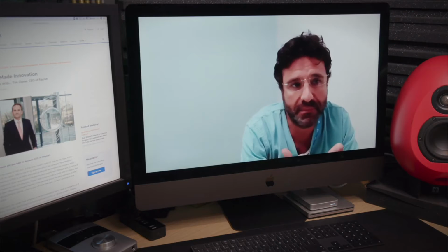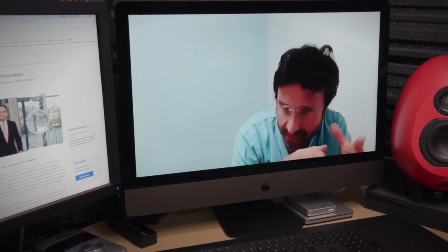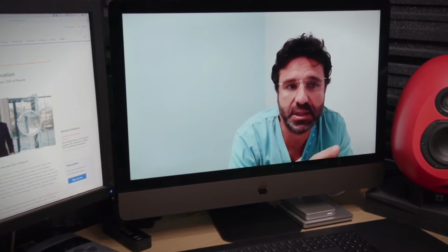And could you share what monovision offset you have been using with this lens? I've been targeting -1 to -1.25 in the non-dominant eye, and plano to -0.5 diopters in the dominant eye. The patients start targeted with -0.5 diopters in the dominant eye. They are achieving 20/20 for distance vision with a seamless transition between their eyes.